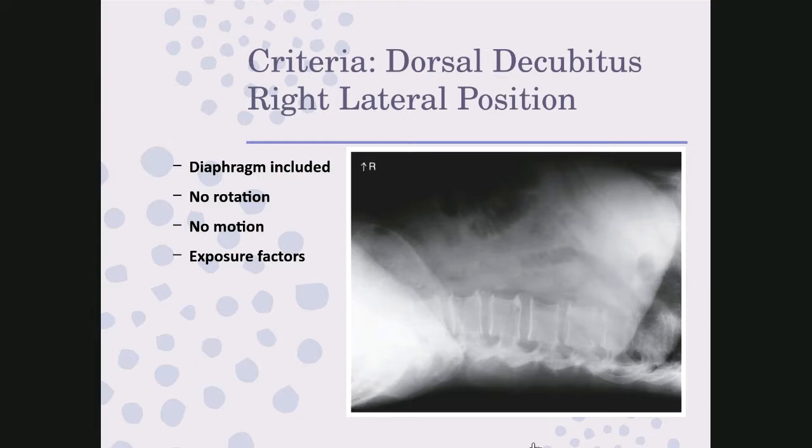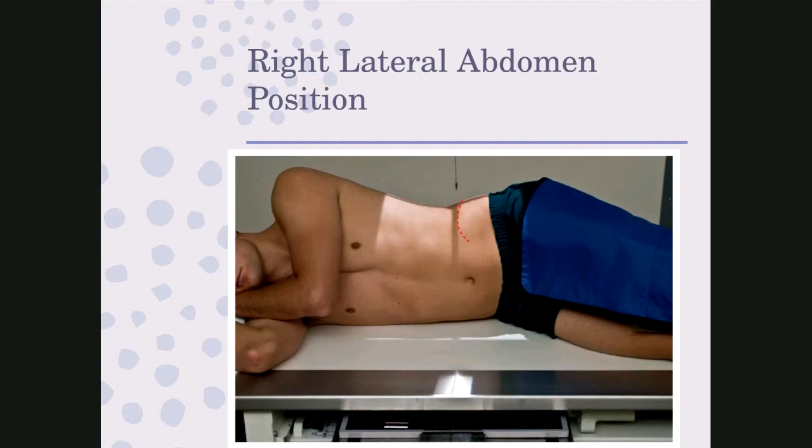All right, so far we've done a dorsal decubitus, an erect abdomen, and a lateral decubitus. And all of those are done to demonstrate air fluid levels, okay? Our next image is simply a lateral abdomen. And this is found on page 124. All right, and a lateral abdomen is simply with the tube up above. If we had the tube, it would literally be over the patient at a 40-inch SID. You would see the tube head assembly right there, and the beam is coming down like this.